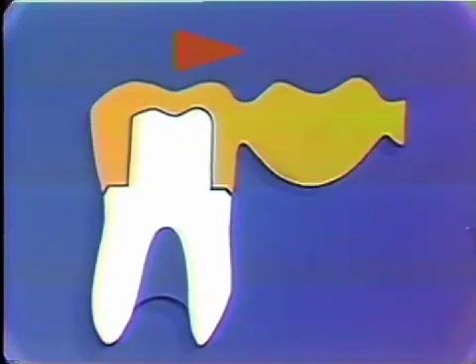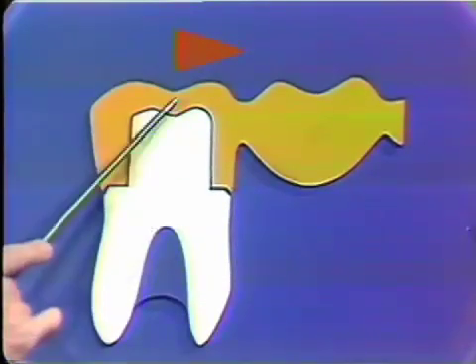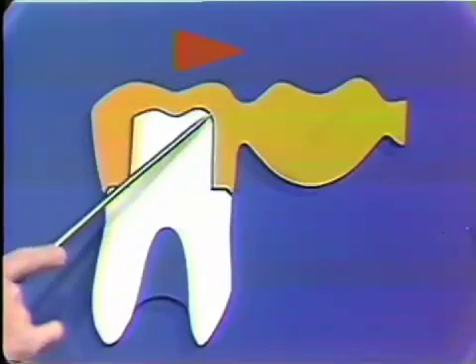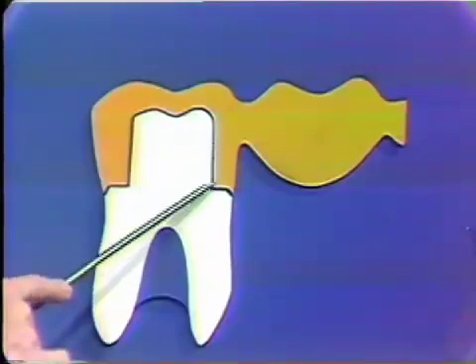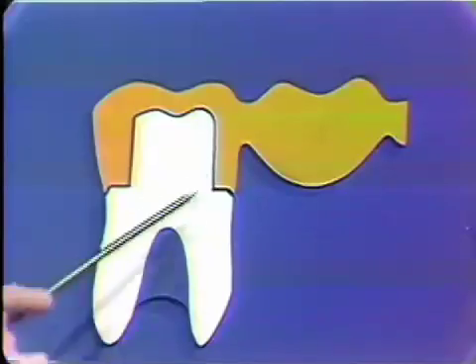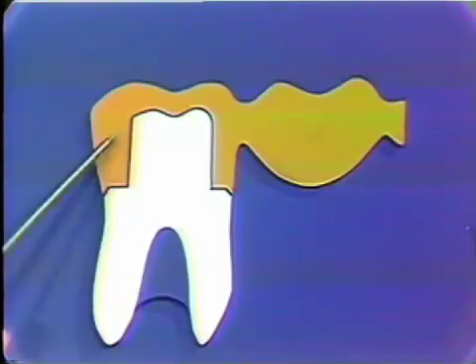As the teeth come into occlusion and the anterior component of force exerts itself, you'll see that in order for this tooth to rotate out of the retainer about this point, this part of the tooth preparation would have to move forward through the gold here, which it cannot do. You'll see also that the cement down here is now subjected to compressive forces and not to tension or shear forces. And it has a very high compressive strength, so it will withstand this type of force over long periods of time and not fragment. And such a retainer will maintain its position in relationship to the retainer satisfactorily.